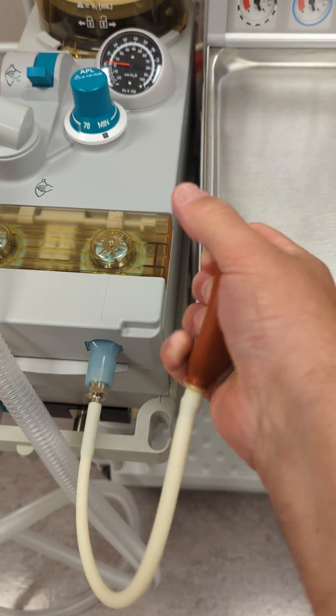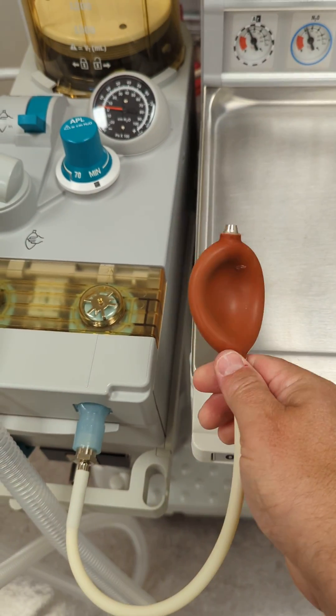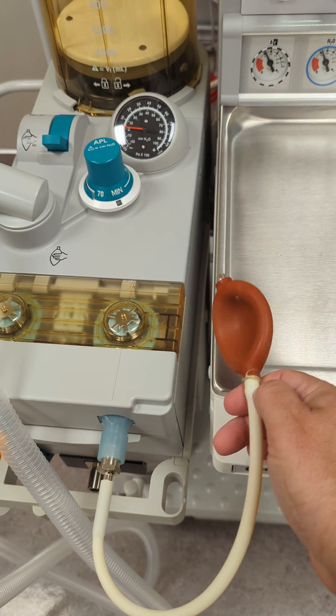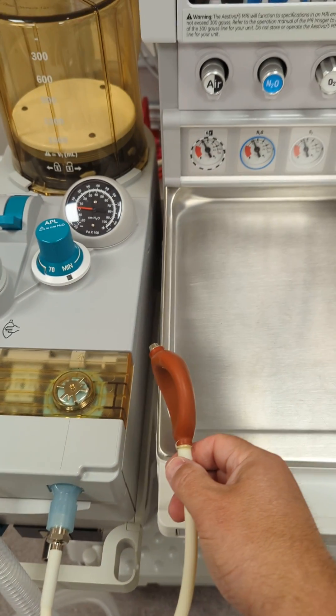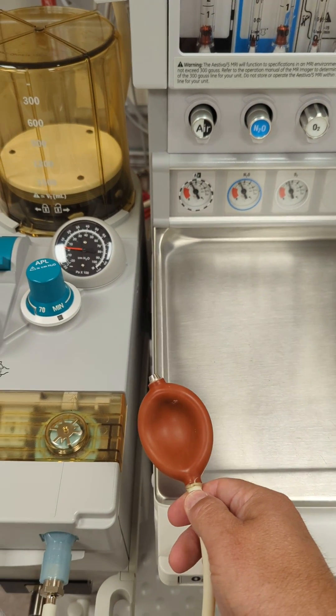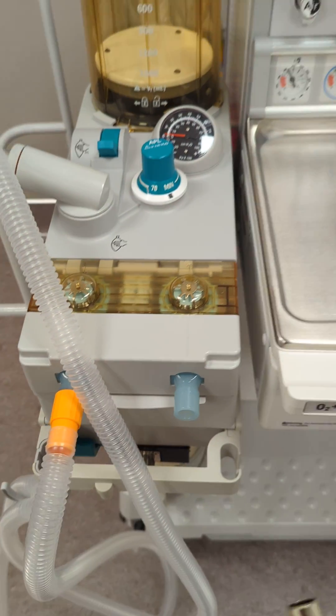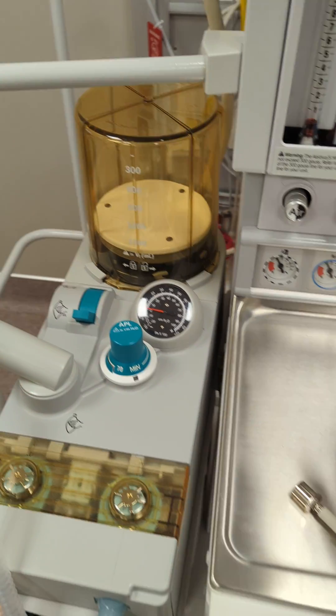Squeeze the bulb. Ensure it becomes relatively flat. Monitor for 15 seconds. If the bulb stays relatively flat, then your leak test for the vaporizer has passed. Ours has passed, so we will disconnect it.